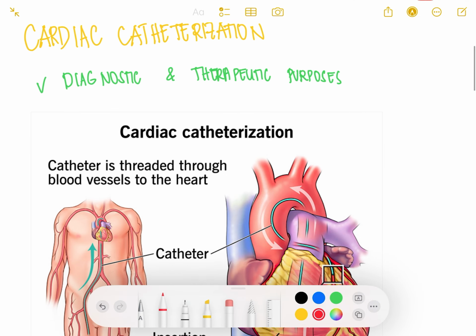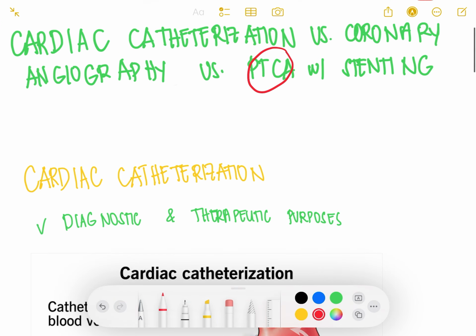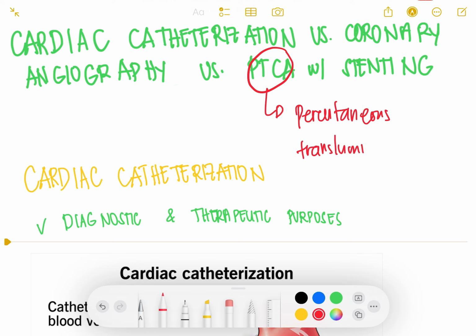Now, let's go back to PTCA. Okay? PTCA. Or, ano bang ibig sabihin ng PTCA? Your PTCA means percutaneous transluminal coronary angioplasty. So, anong ginagawa dito?